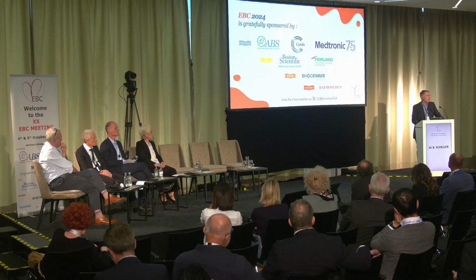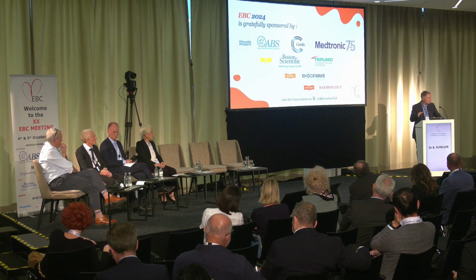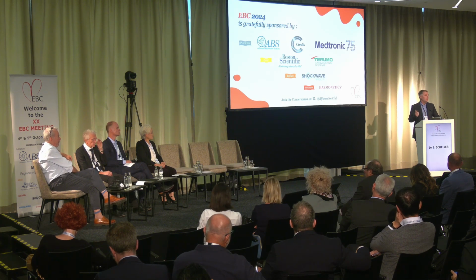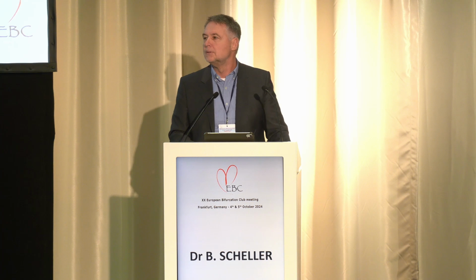I usually start, independent of whether it's ISR or de novo, by prepping the main branch, then doing lesion preparation of the side branch, applying the drug in the side branch, and applying the drug in the main branch. So that's the typical way. And if you then have carina shift or whatever, then you can do kissing with conventional balloons to have the mechanical optimization.